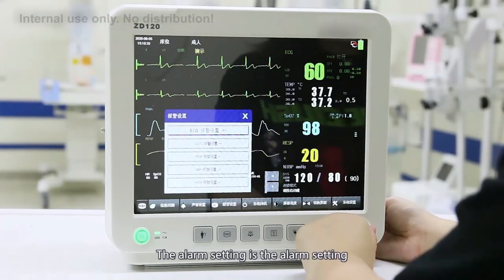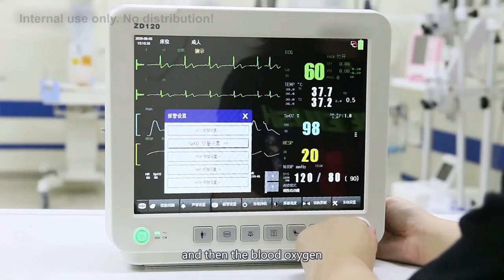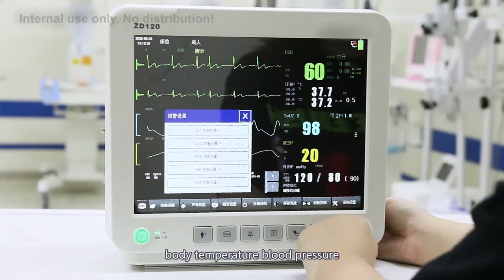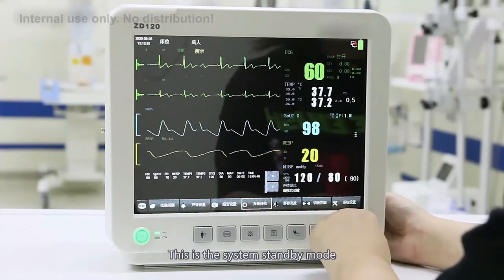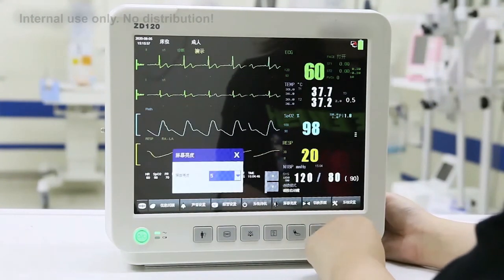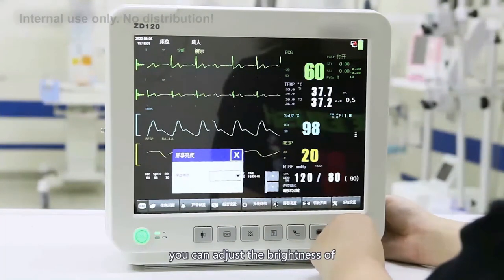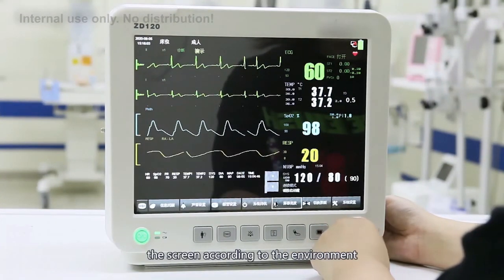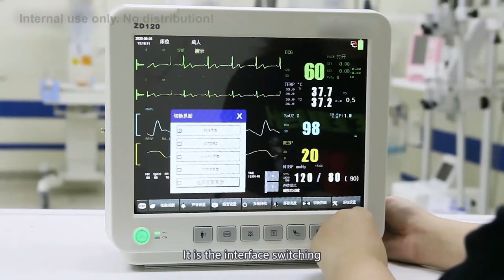The alarm setting covers the alarm configuration for all parameters, including ECG, blood oxygen, body temperature, blood pressure, and respiratory rate alarm settings. There is also a system standby mode and a screen brightness adjustment, so you can adjust the brightness according to the environment.